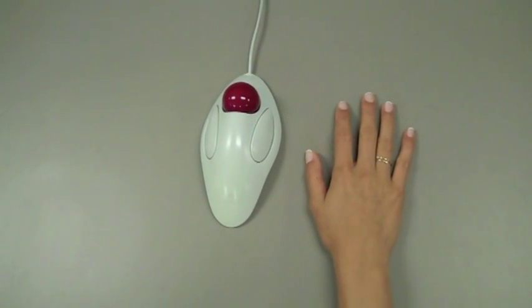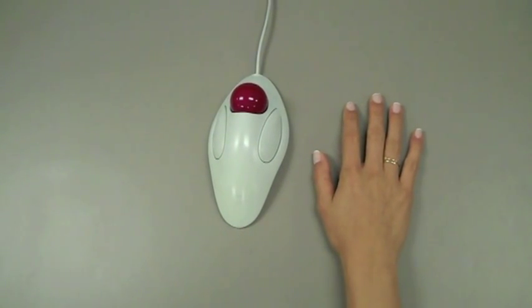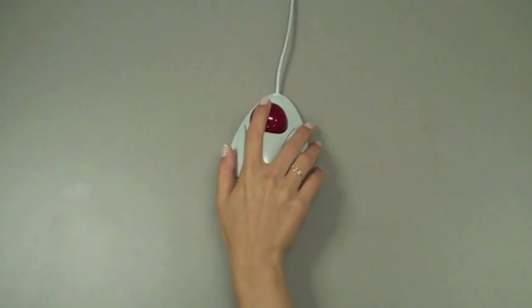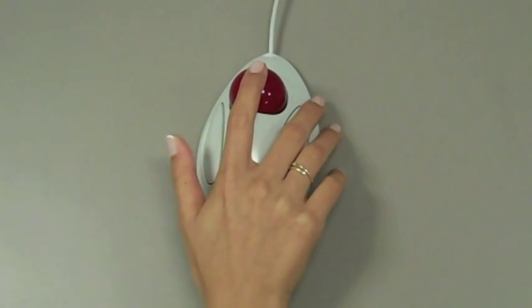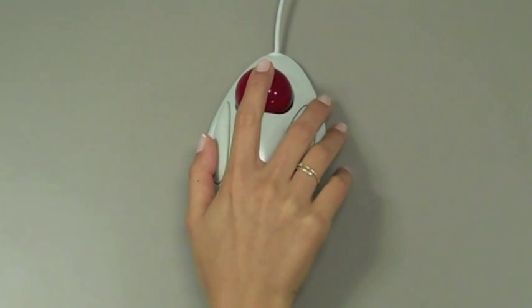The last computer mouse is the index trackball mouse. The participant's hand is in a neutral position next to the mouse. Now let's have her put her right hand on the mouse. As you can see, her index finger is on the trackball, her thumb is placed on the left button, her third digit is placed on the right button, her fourth and fifth digits are on the right side of the mouse.